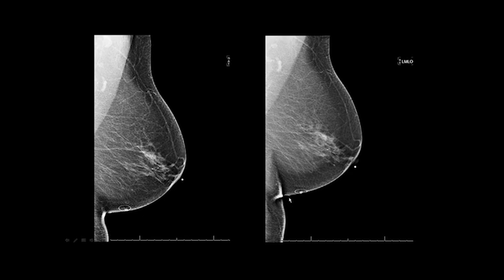So therefore, the last thing the technologist should do before they go and make the exposure is bring their finger underneath the breast and smooth this out with just one little swoop. It just takes a second to do, but you could see the huge difference that it makes and the prettiness that it makes on the positioning.